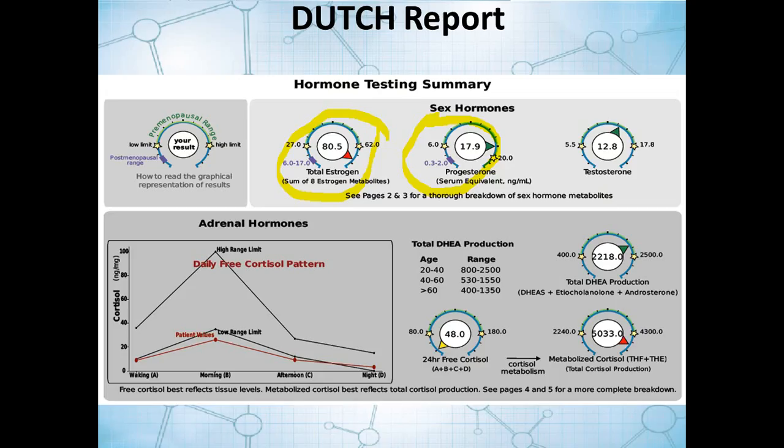So this is actually a calculated value here, and for any of these you can see the reference range. For women, the premenopausal range is up here, and then the postmenopausal range is that little purple band at the bottom. For all other scenarios where there isn't a pre and a postmenopausal difference, or for men, the reference range is simply up between the stars here.